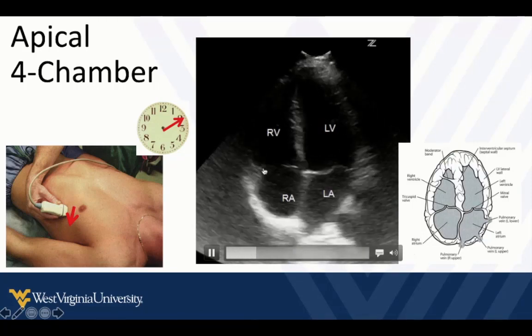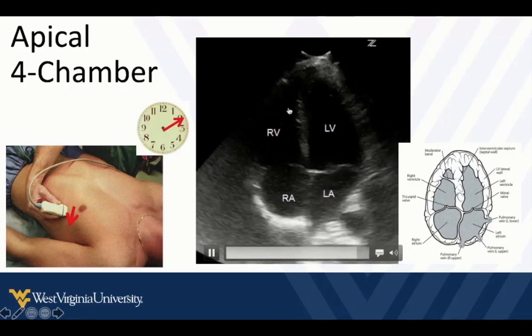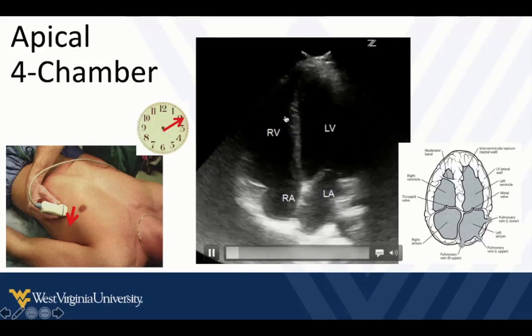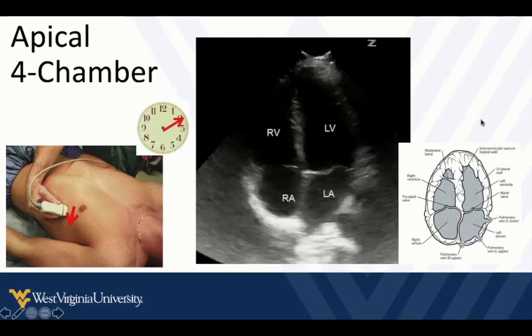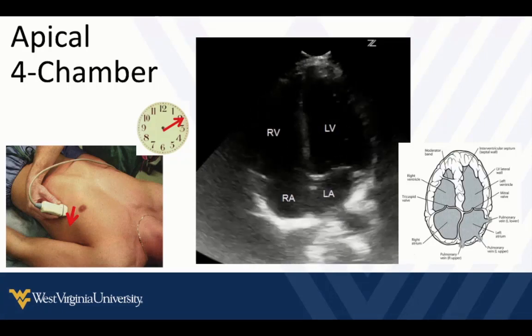The right side has more of a triangular shape. The tricuspid valve sits just slightly closer to the apex compared to the mitral valve. In some views, we can see the moderator band coming down — we don't see it that well in this view, but you can see it in the cartoon. Those are things to help us differentiate the right ventricle from the left ventricle, so we can avoid diagnostic errors from probe malpositioning or setting abnormalities.